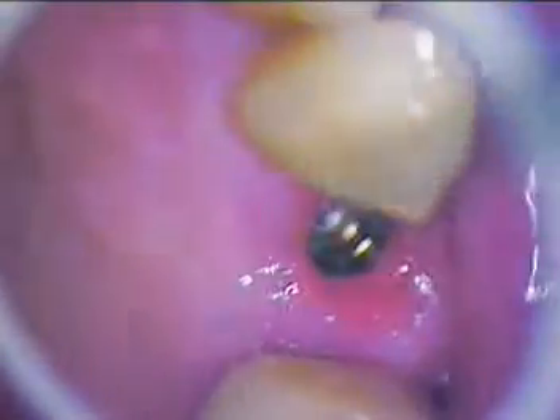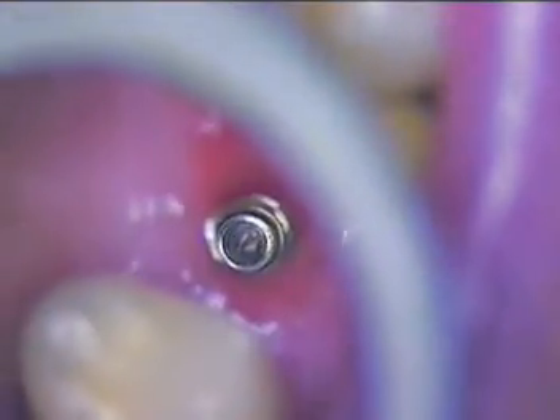So we'll say goodbye to the temporary and go ahead and vacuum out and dry the implant site. You can actually read the serial number down there on the implant. We want to make sure the threads are clear — and they are, very nice.